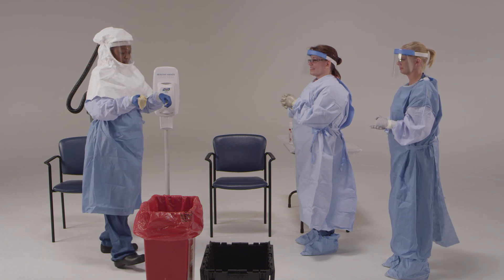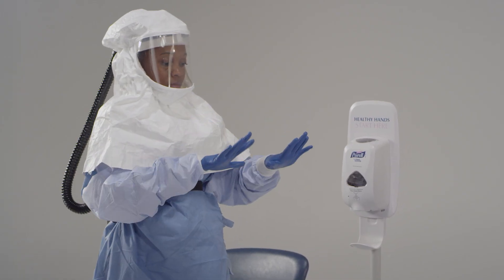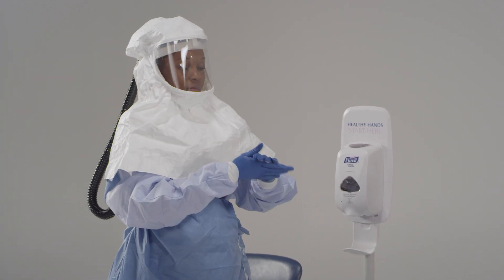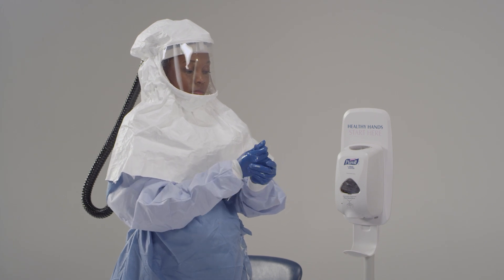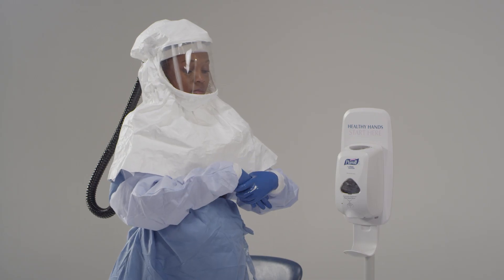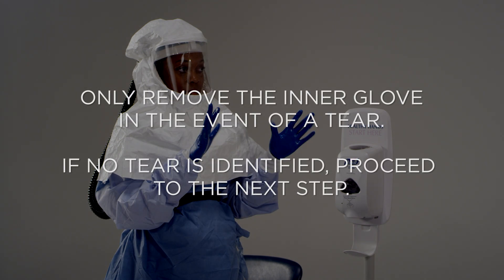Dispose of the gloves. Now inspect both sides of your inner gloves for visible tears or contamination. If you don't see any tears or signs of contamination, disinfect your gloves with EPA-registered disinfectant wipes or alcohol-based hand rub and proceed to the next step of removing your respirator. If you see a tear, hole, or signs of contamination in the inner glove, disinfect with EPA-registered disinfectant wipes or alcohol-based hand rub and then remove the inner gloves, making sure not to contaminate your bare hands. Once the gloves are off, perform hand hygiene with alcohol-based hand rub, then put on a new set of gloves up to the edge of the gown sleeve.